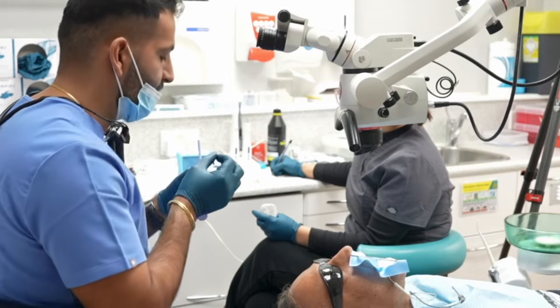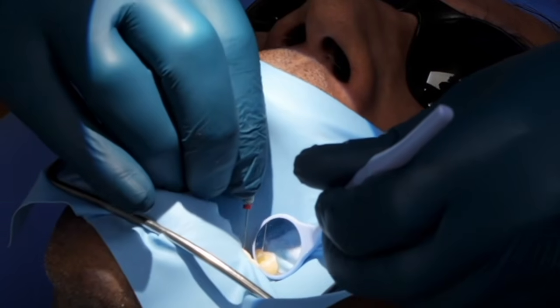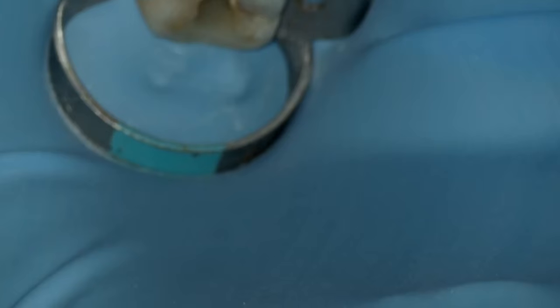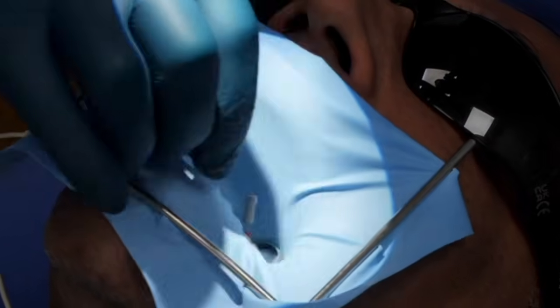After the glider, we use the shaper, and the shaper is an 18 4.5% taper. It did require a few passes to get down, but if you look at the preoperative X-ray and analyze the case, the canals were quite constricted, and also very narrow. So it was going to take some time to get there.